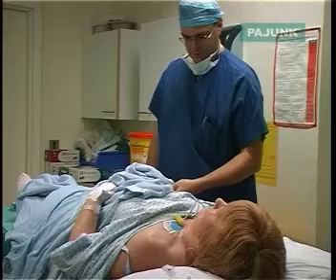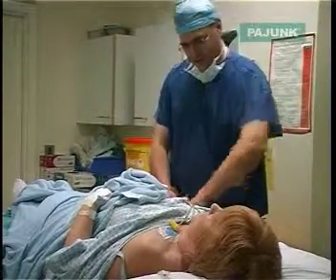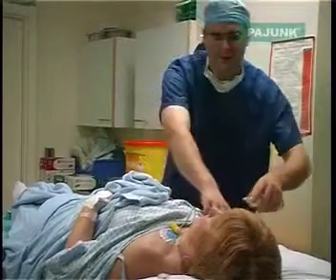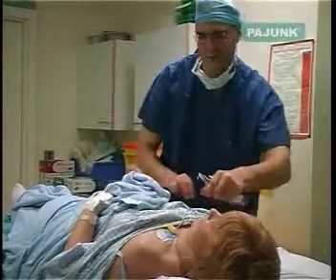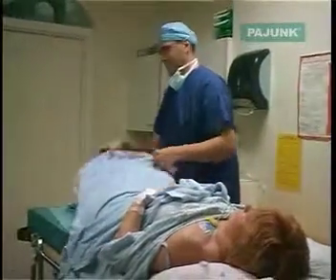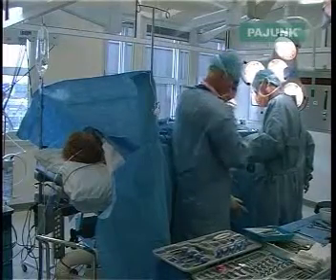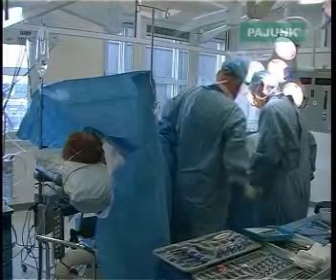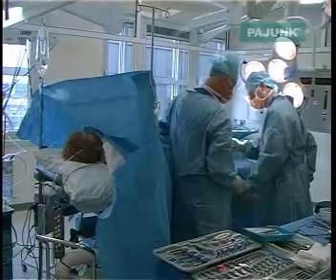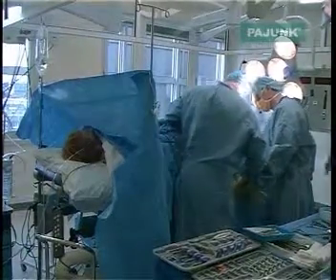After a few minutes the block can be tested in the normal way. I find that continuous spinal anaesthesia using this equipment is a straightforward and reliable regional anaesthetic technique. In some patients it has advantages over other regional techniques — one such group is patients with cardiovascular instability, in that lower doses of local anaesthetic can be used and the block can be brought on more gradually.